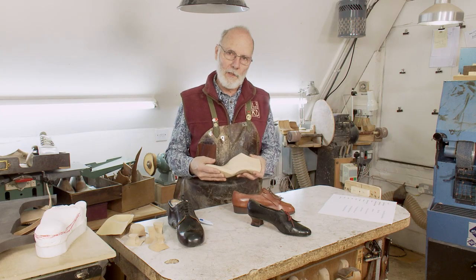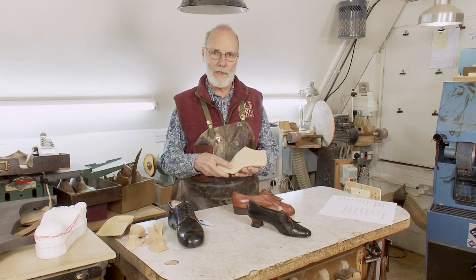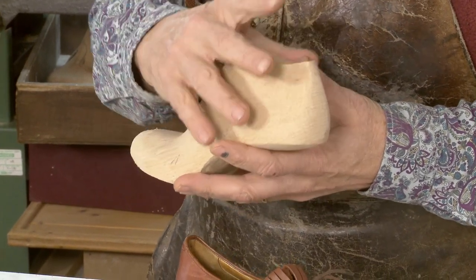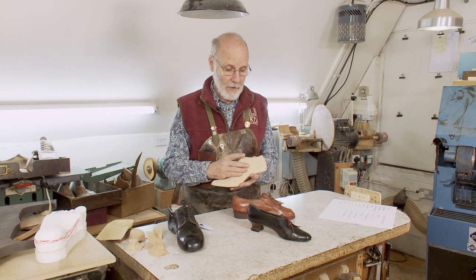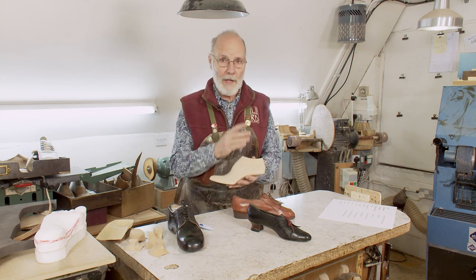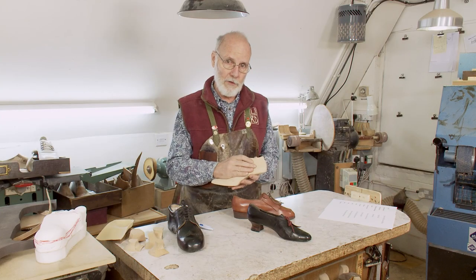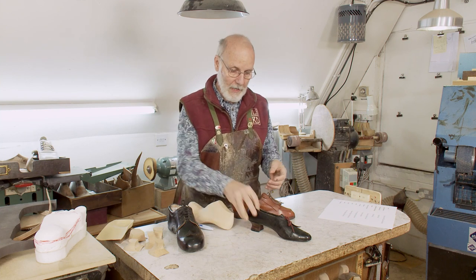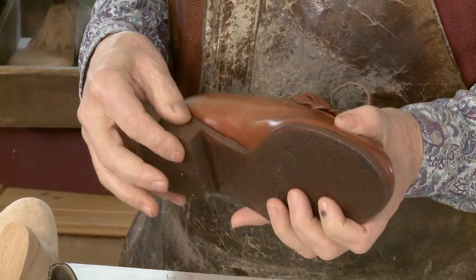Up until now, we've just looked at how to measure for and how to make a bespoke orthopedic last. A lot of people think that once you've got the last, you can do anything with the shoe, and it doesn't matter because it's all to do with the last — and that's not true. Although the last is the core element of bespoke orthopedic footwear, and without one the whole thing is a struggle, it's only one-third of the process. The other two-thirds being the uppers, and the soles and heels.